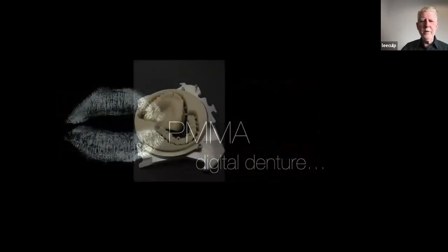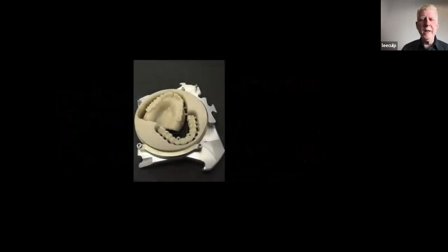Now, so then we moved to digital dentures. So in the beginning, you could design a base and mill that out or print that out, then buy the denture teeth and glue them in the holes. And I'm like, okay, still, that doesn't make any sense. So again, I've got amazing people here. I said, all right, take that file, because you still have to design your denture teeth.